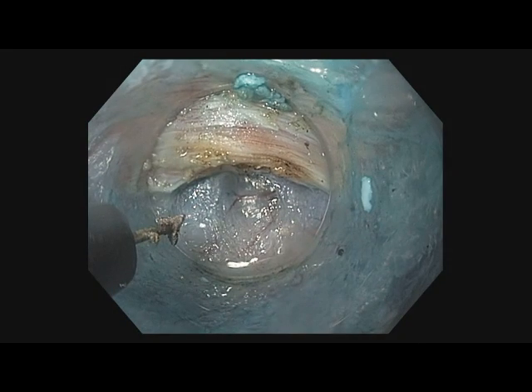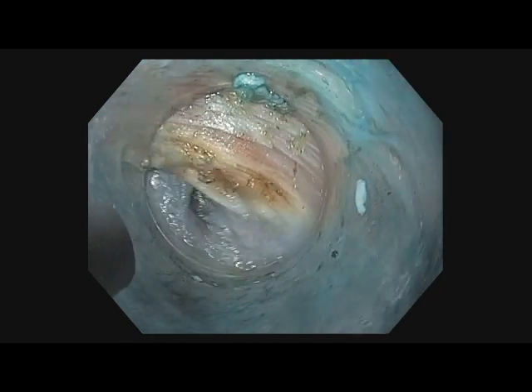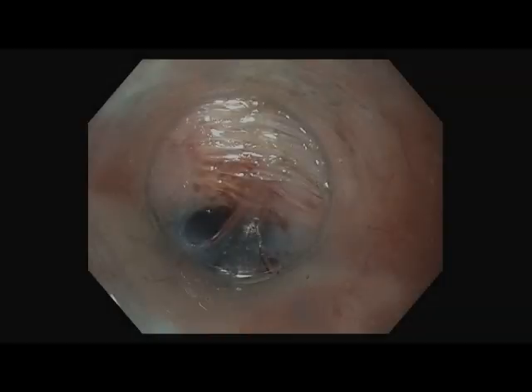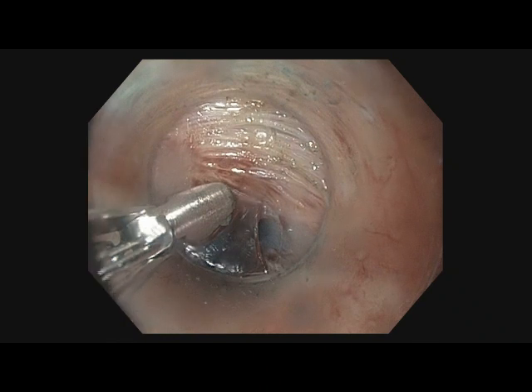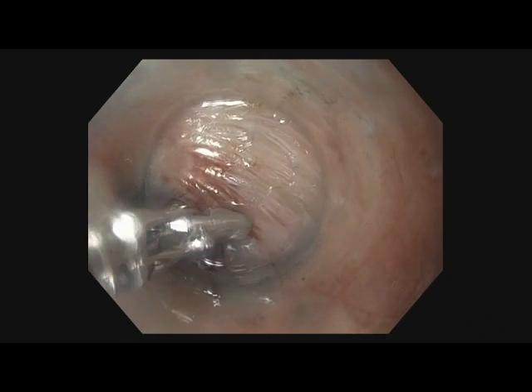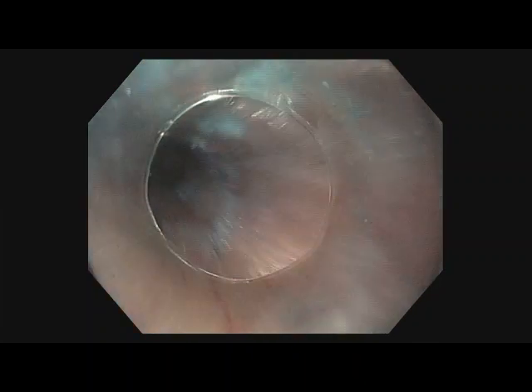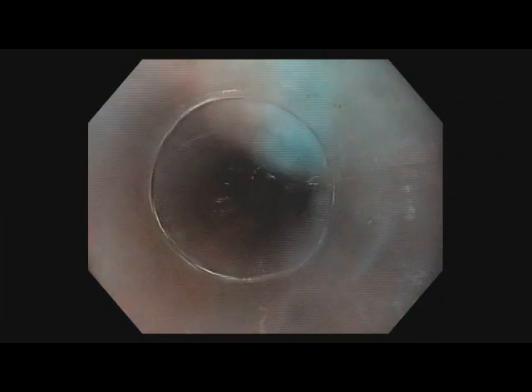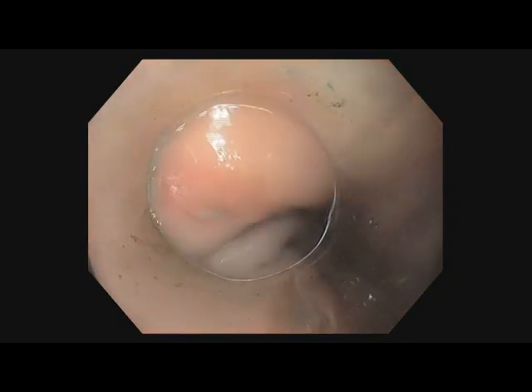The appearance of palisading vessels, as well as tunnel narrowing, signified the transition between the esophagus and the stomach. In that area, vessels may be coagulated with a coag grasper to progress through the tunnel. After this step, the scope is maneuvered into the true lumen, and the submucosal tunnel is identified by blanching of the mucosa.